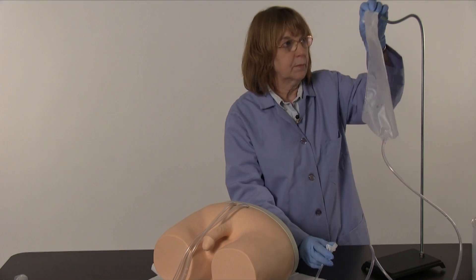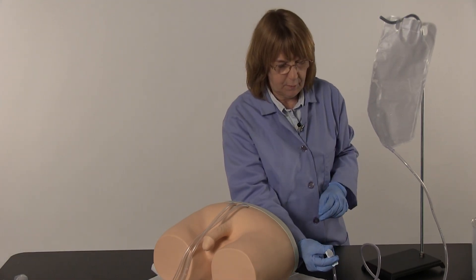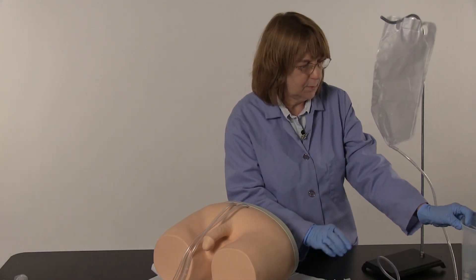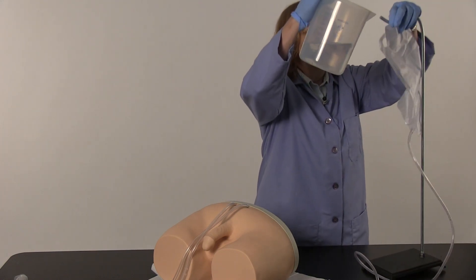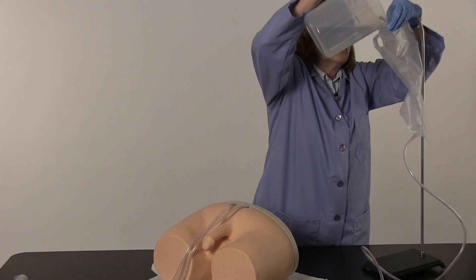Setup. Hang the fluid administration set approximately 18 inches above the simulator. Ensure that the slide clamp is closed and fill the fluid administration set. To extend the useful life of your simulator, NASCO recommends using distilled water.